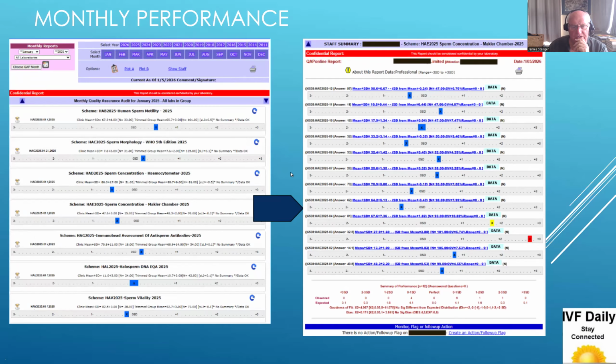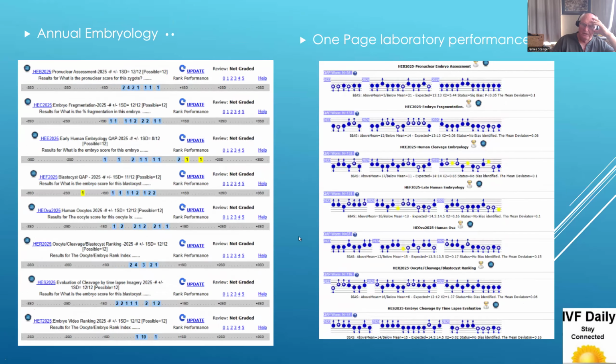And you can go back and look at the same thing for each month. You can look at the monthly performance and how they've gone each month, getting the same outcome. And then at the end of the day, just to finish off, you can drill down through each staff member, then come back up and look at the performance each year, for a whole year, each individual performance of the clinic, and then click to drill up to get a one-page summary for the last 2.5 years.